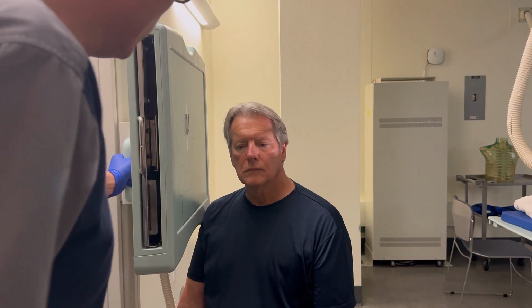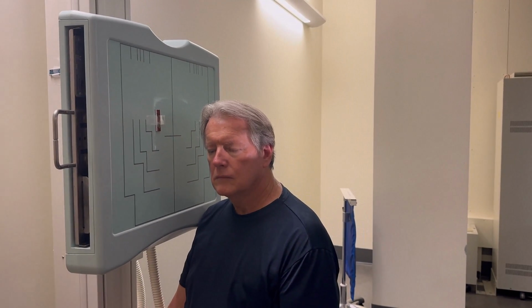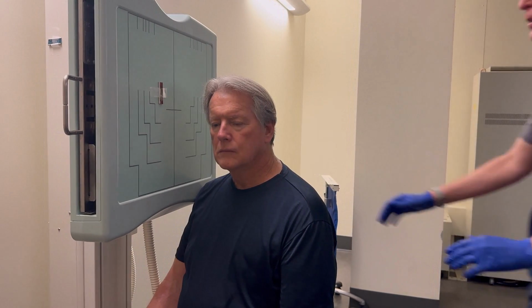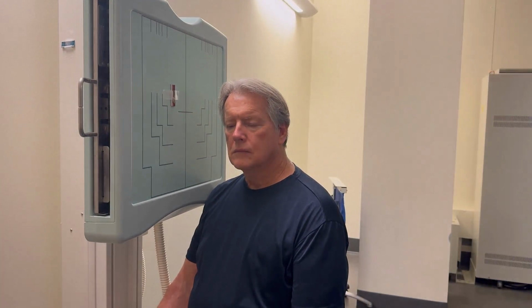The cranial line we want this time is the IOML, should be parallel to the floor. You just need to bring your chin down a tiny bit. That's good. For centering, Merrill's has this kind of in between the outer canthus and the EAM, but it varies patient to patient. So I'm going to be using landmarks to kind of dial in my collimation.